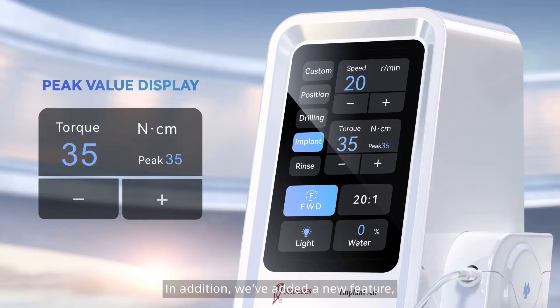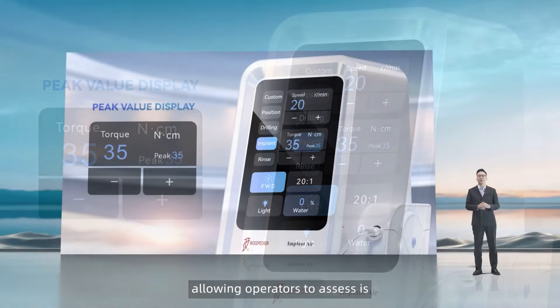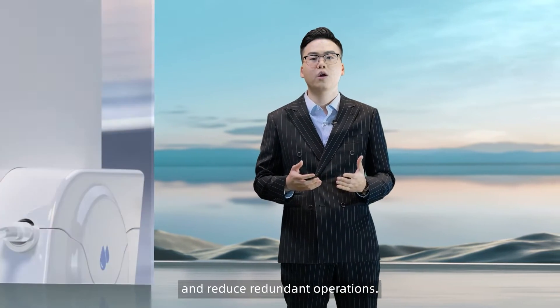In addition, we've added a new feature that displays the peak torque output, allowing operators to assess the highest torque during the operation, confirm the initial stability of the implant, and reduce redundant operations.